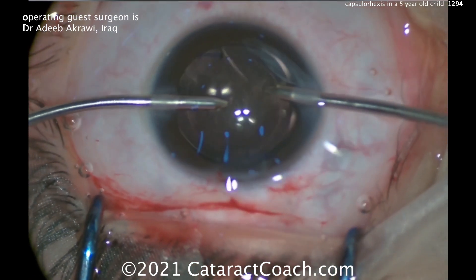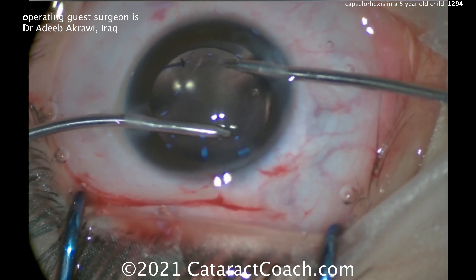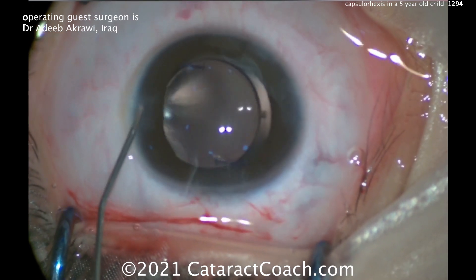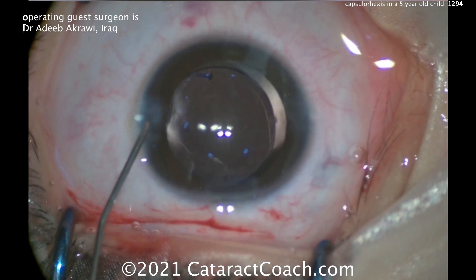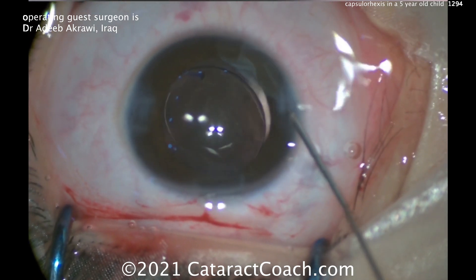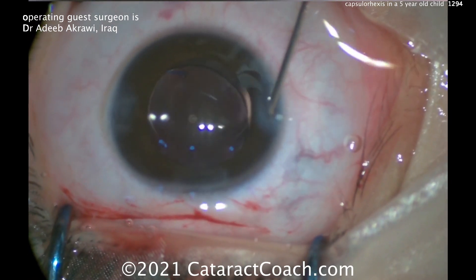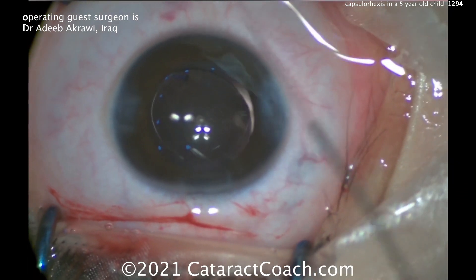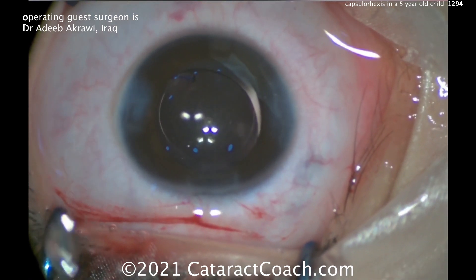Now centering it up and taking out the viscoelastic. There are lots of challenges in a very young child. In a baby less than 1 year old you're not going to be able to do a rexis — you may have to try other techniques. For congenital cataracts in newborns, you can try Ken Nischel's two-incision push-pull technique, which works very well. Keep in mind elasticity varies with patient age: the younger the patient, the more elastic the capsule, and the more difficult it is to create a capsule rexis. But in this case — beautiful result. Thanks for sharing.